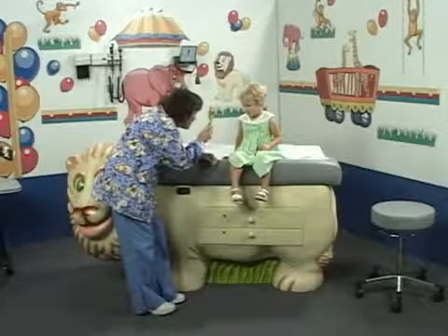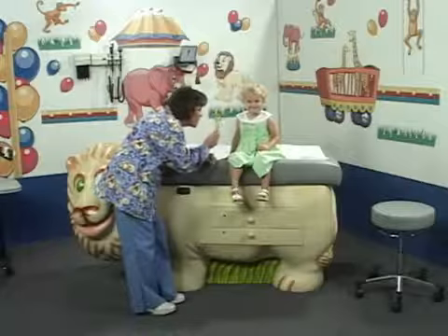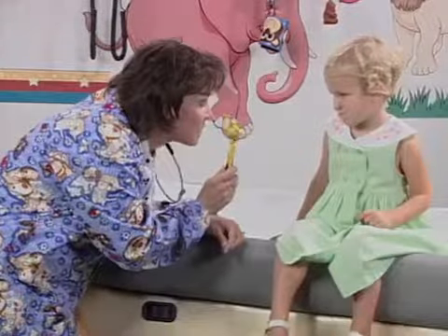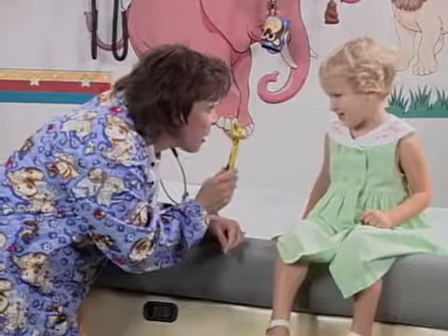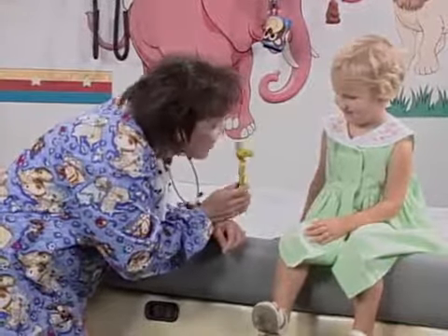Here's another example. This reflex hammer and the right words work together to relax a child and make checking reflexes much easier. Hello. You like it? He's very nice, and you know what he loves to do? He loves to give kisses right on your knee. Isn't that silly? Do you want me to have him give you a kiss on your knee? The exam goes much more easily with a relaxed patient, and the approach creates an enjoyable experience for patients and parents.